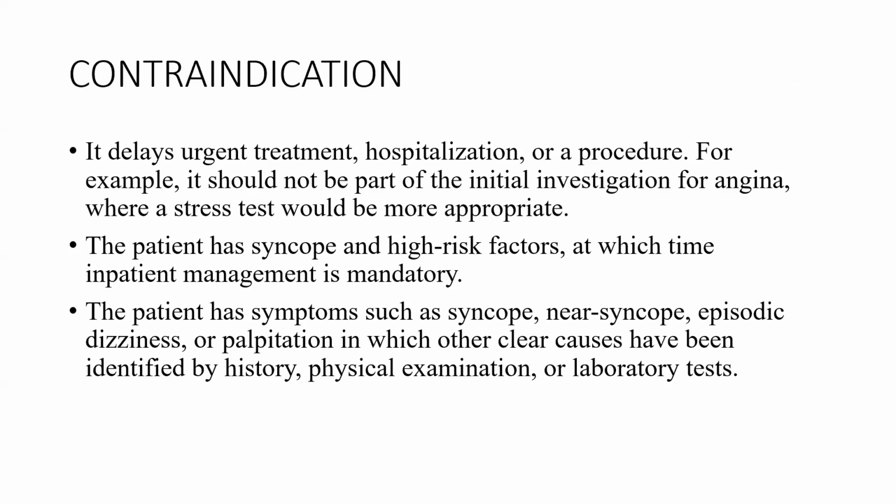So what are the contraindications for Holter? It is if it's going to delay treatment or hospitalization. For instance, patients with angina pain would benefit from other modalities of investigation and treatment, so we shouldn't delay it by saying, let's do a Holter to see what it is. Or patients with syncope and high risk features that will need immediate treatment shouldn't be placed on a Holter to try to correlate it. Treatment will be more important at that point.